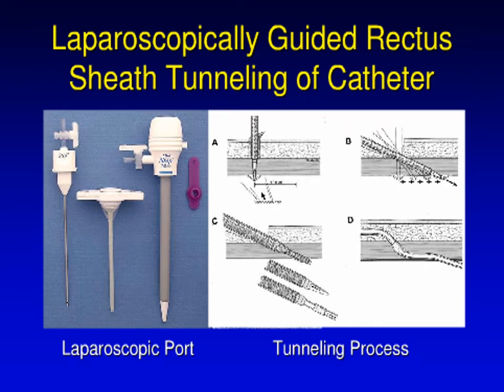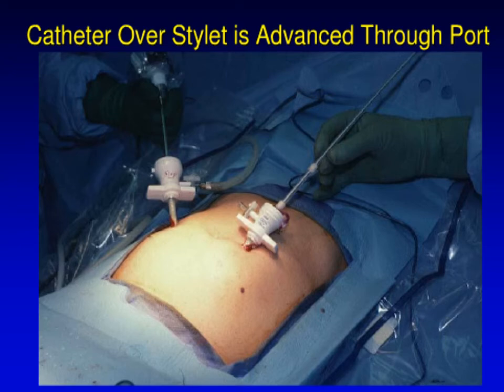As we can see here, these are the trocars used for PD catheter insertion by laparoscopy. Here, one in the paramedian, where the catheter, as you can see, can be forwarded through this trocar into the Douglas pouch. And this is the other hand that will help to catch the catheter and direct it.